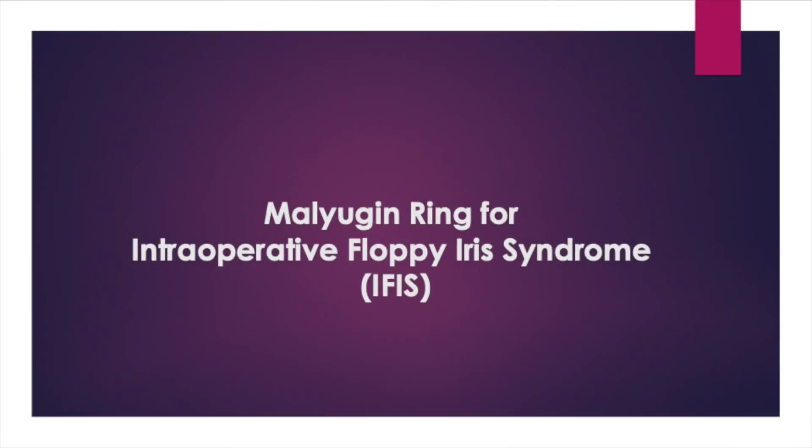In patients with small pupils, especially those on medications known to cause intraoperative floppy iris syndrome, pupil expansion devices can be lifesavers. I will present just a few pearls on insertion and removal techniques of the Malyugin ring. Although this is my device of choice, please note that there are other pupil expansion devices on the market.